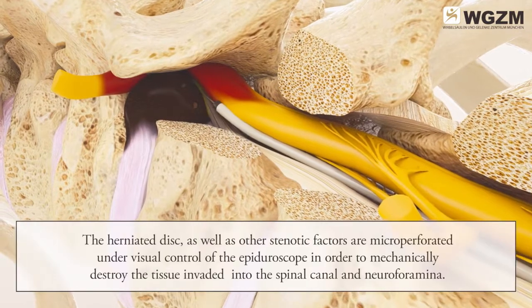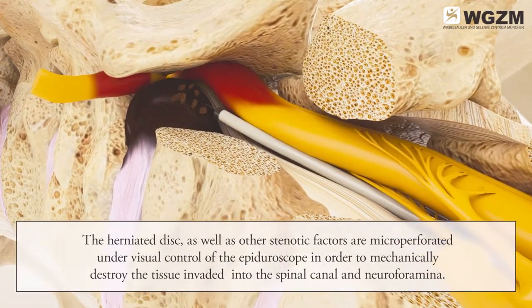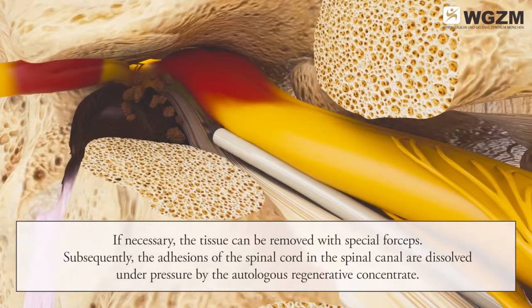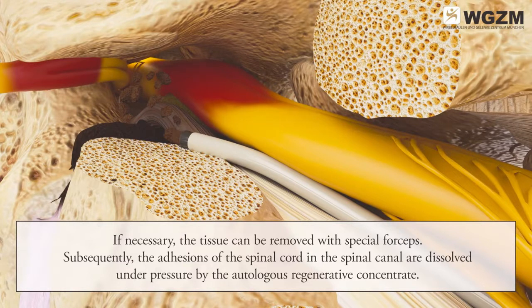The herniated disc as well as other stenotic factors are micro-perforated under visual control of the Epiguroscope, in order to mechanically destroy the tissue invaded into the spinal canal and neuroforamina. If necessary, the tissue can be removed with special forceps.